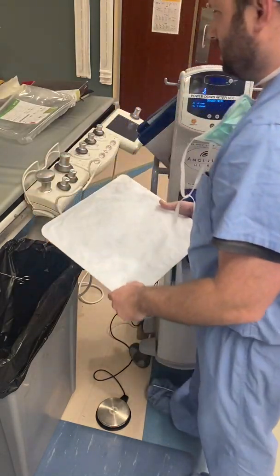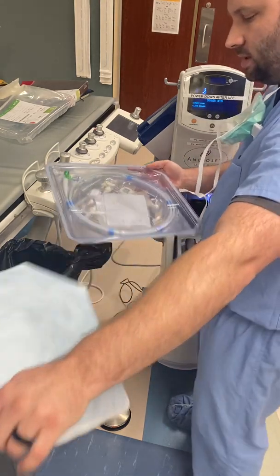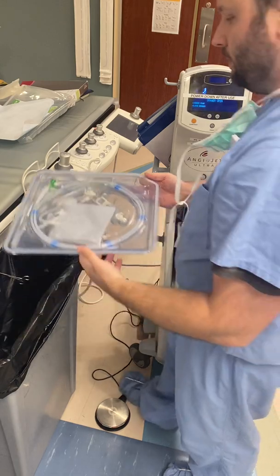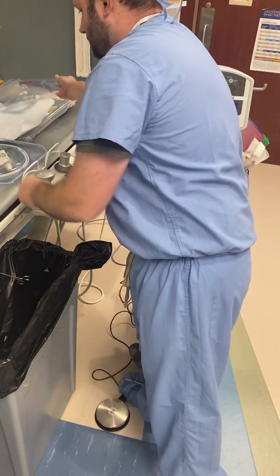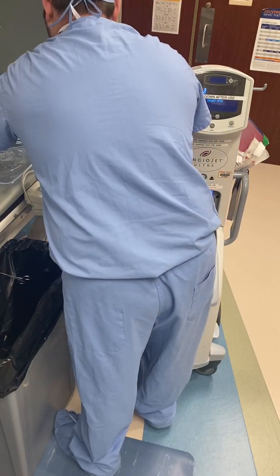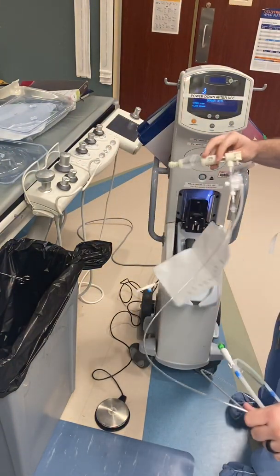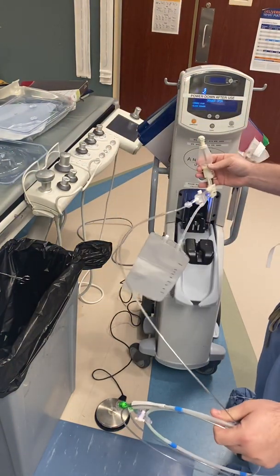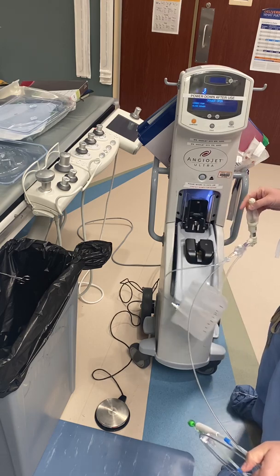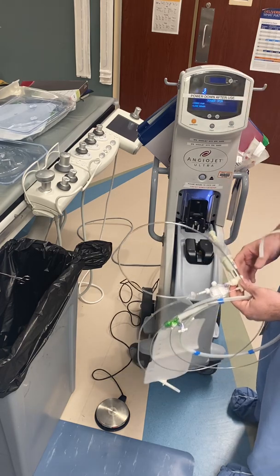For this I have an expired catheter from our training box — this is a Solent over-the-wire, a 90-centimeter catheter. It's sterile, so you have to open it sterilely for the scrub person. The drawer will open automatically when you turn it on — it's an insert pump. There's a little code on the side of it; the AngioJet console will automatically recognize whatever catheter is placed in it.